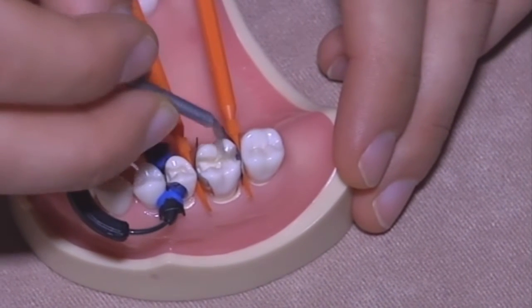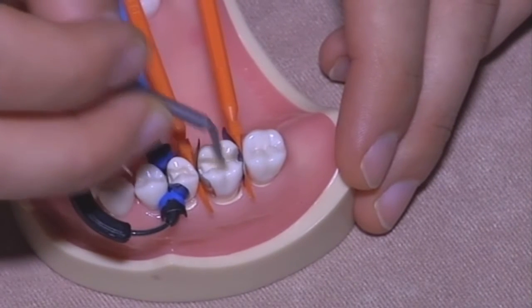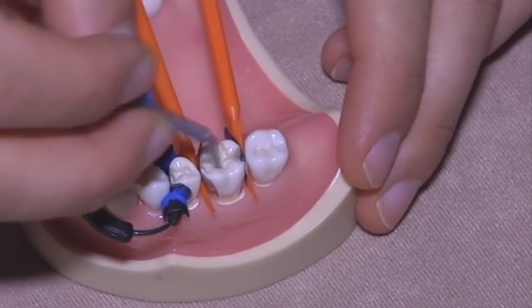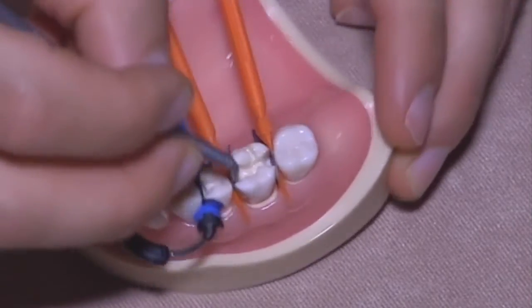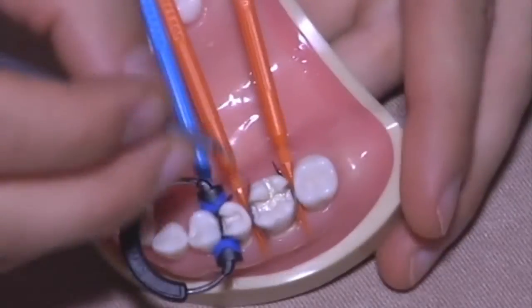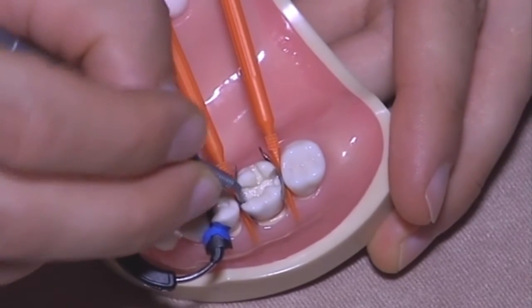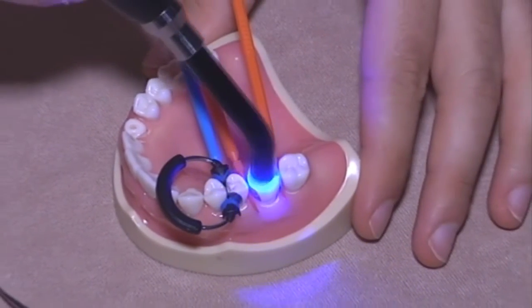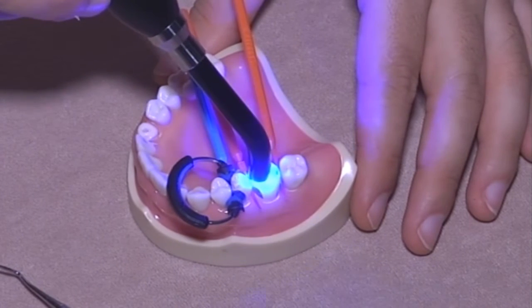And here the procedure is again the same, so be precise and meticulous in applying a lot of bonding agent everywhere. Blow again and then push it again. We saw the procedure, and light cure at least 20 seconds. Okay.